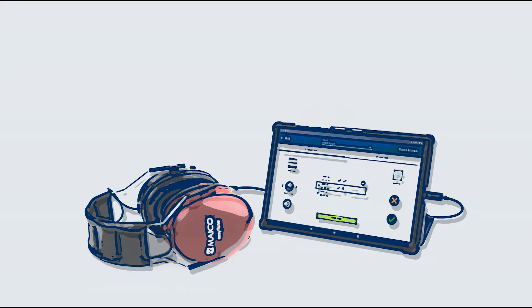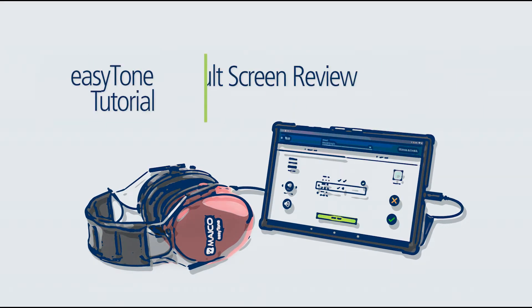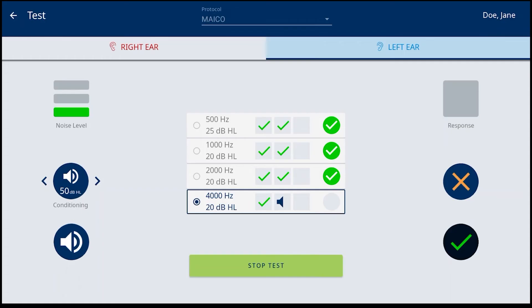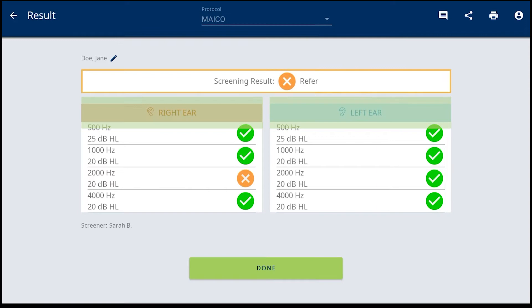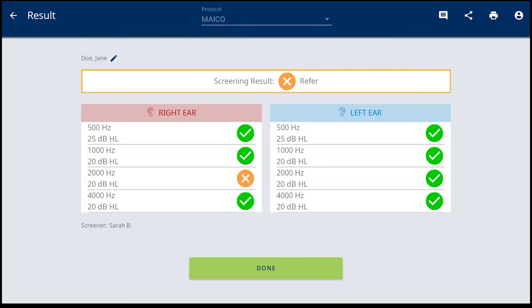This tutorial is to review the result screen operation. When the hearing screening has been completed, the EZtone app will immediately move to the result screen. The overall result, as defined by the protocol, is displayed at the top of the screen with individual ear and frequency results provided below.